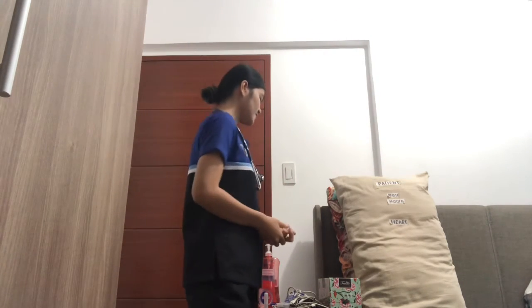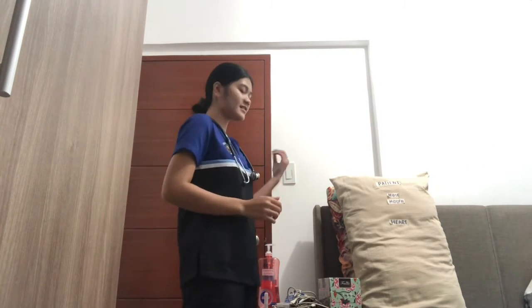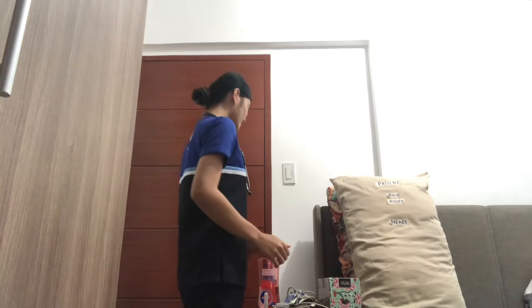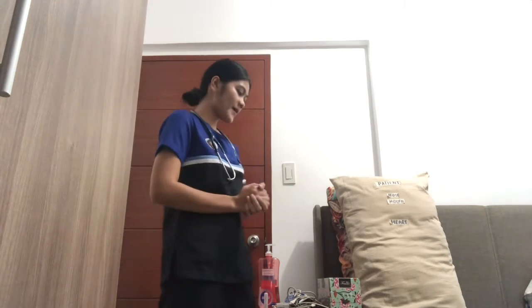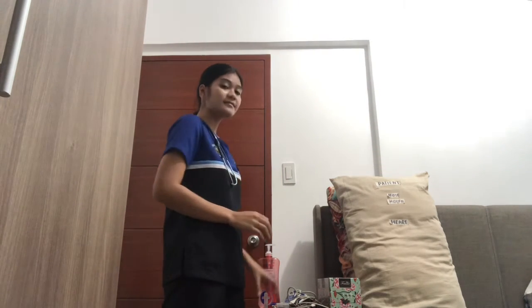So, after that, we will now start preparing the nebulization. By preparing the nebulization, first, we should plug the nebulizer compressor to the power source. And after that, we will prepare the medication.